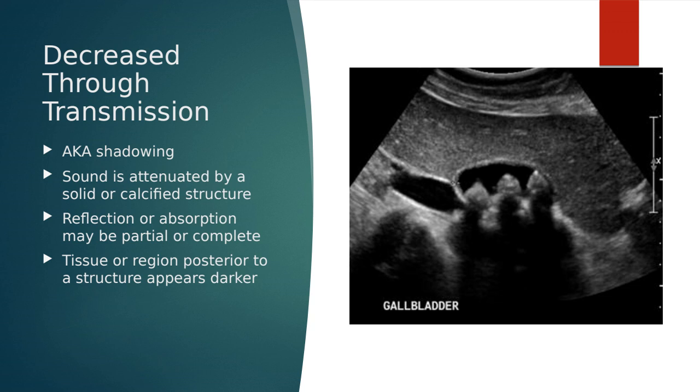So here, very hyperechoic, high attenuation gallstones, calcified structures. The sound wave hits them, is very absorbed by those gallstones, and posterior to those gallstones, we get all this shadowing. We're not getting any helpful information posterior to those gallstones. So it's just like a blackout right in that region.